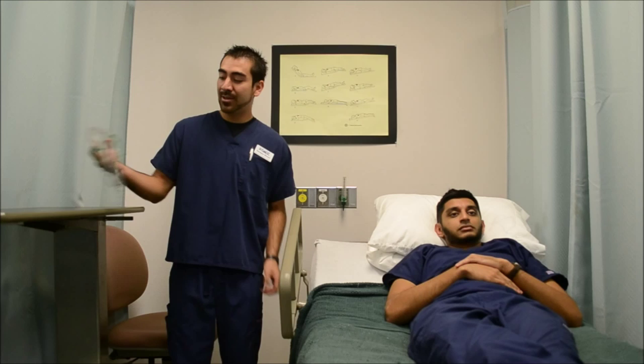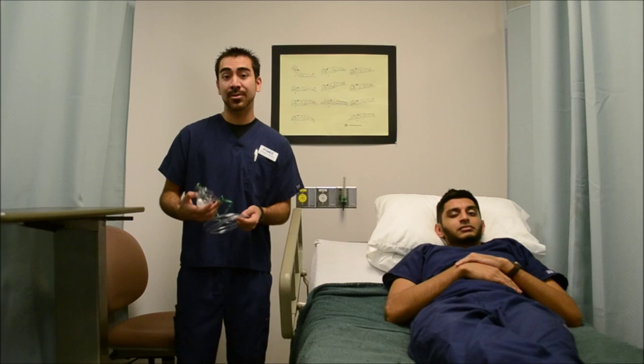Hello, my name is Enrique and today we are going to be going over the SimpleMask. The SimpleMask is an oxygen delivery system that delivers an FiO2 between 35% and 50%.